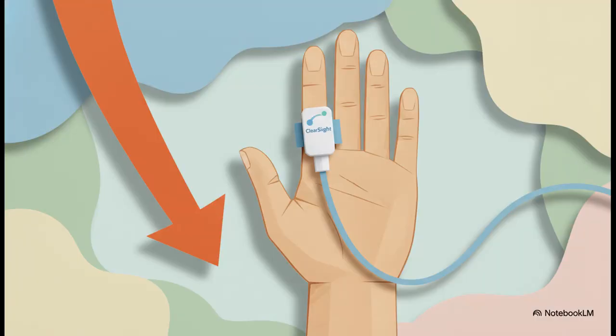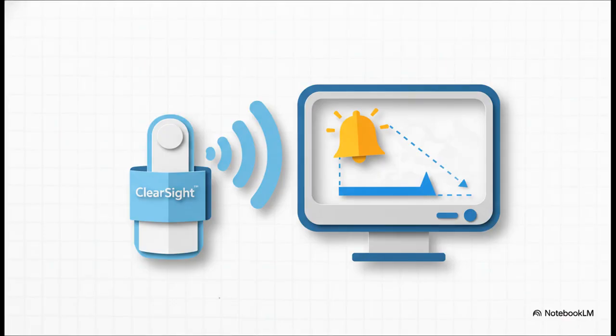Now, let's pivot to a completely different clinical scenario: cesarean sections under spinal anesthesia. This is a really important study because it tests HPI's performance using the totally non-invasive ClearSight finger cuff in a patient population famous for having rapid and significant hypotension after a spinal. So the goal here was to see if HPI still worked well when it was getting its data non-invasively.